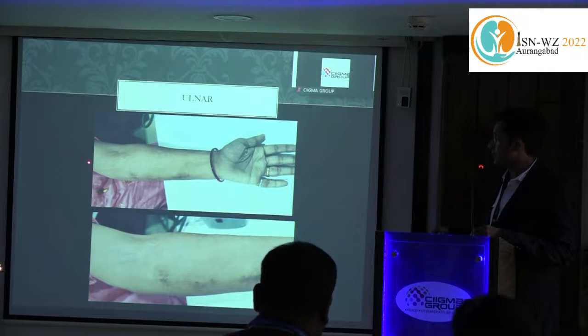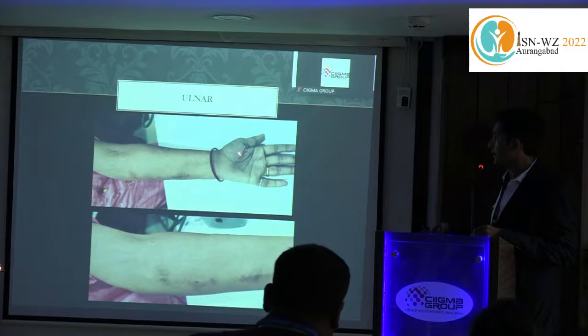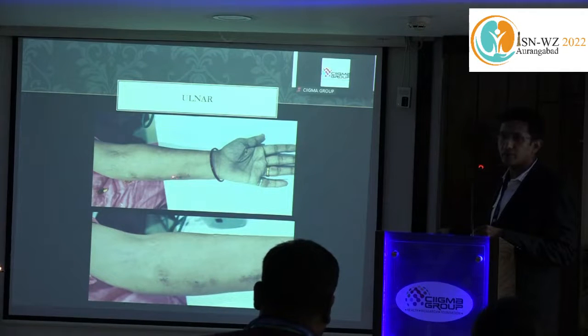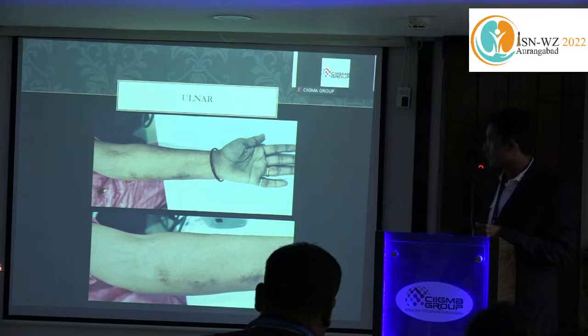If you see the continuation of the basilic vein, you can see the small basilic vein here. We did a Doppler, and the ulnar was patent, the Allen test was good, so everything is okay. So we constructed a basilic ulnar fistula on this side. So sometimes you try and utilize both sides rather than directly jumping towards the elbow fistula.